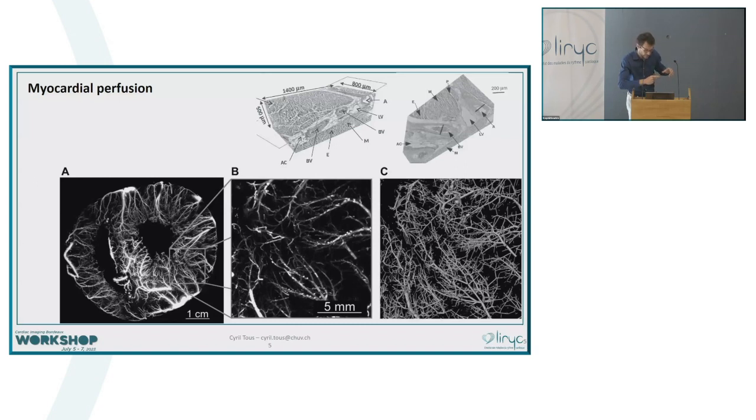Because of different pressure, the perfusion actually changes during this study. If you look at only the arteries, you can see that in those segments, the perfusion is different. You have hypervascularization of the septum, and some of the other regions don't have this.